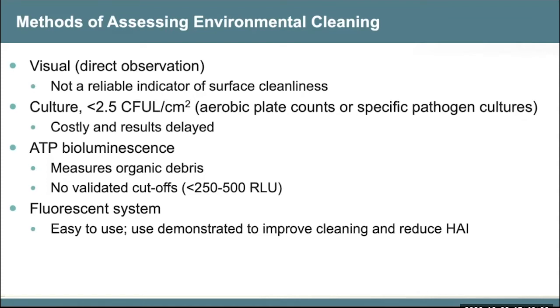We like the fluorescent system: easy to use, demonstrated to improve cleaning, and demonstrated to reduce healthcare-associated infections. A little invisible dot is put down. I don't have a picture. You use a black light, and you can see it. The supervisor goes in and dots different objects in the room, varied so the worker doesn't know where. After it's clean, they go in and look for the dot. It's physical removal. It's a measure of cleaning, not a measure of disinfection. We do this routinely in about 5% of our rooms. We monitor it and give feedback to our environmental service workers, although we don't prefer the term feedback. It's a little pejorative. We use the term just-in-time coaching, and we look at that every month at our infection control meeting.